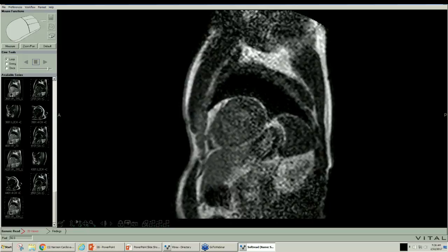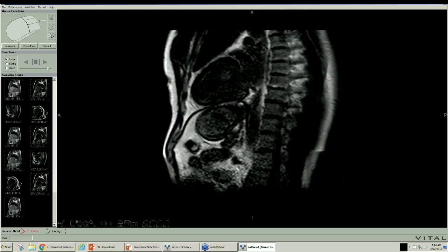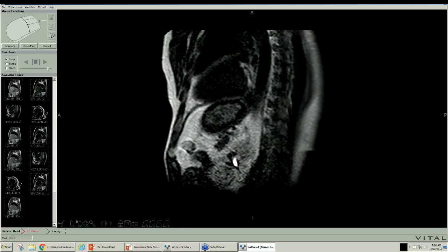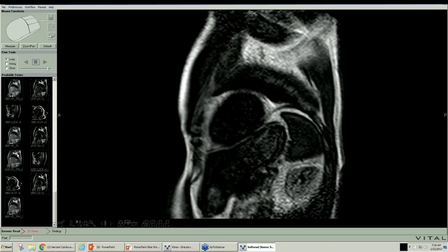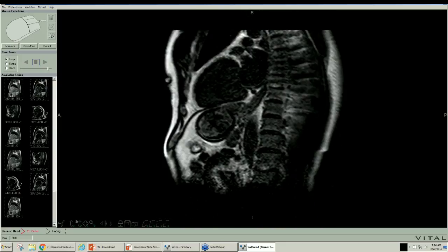And so Dr. Morales was there that day, and we had this in two consecutive patients. So we bought a new coil. I think he berated the tech a little bit. And this is an inconclusive study at this point in terms of late gadolinium enhancement, in that we just can't get it right. And so we'll talk about that in a minute. So let's go back to our slide deck.